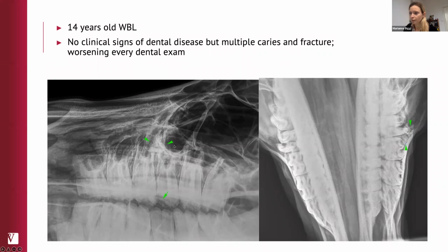So I'm quite happy that there is periapical remodeling associated with this tooth. There might be other fractures on other teeth, but I don't think we'll be confidently able to diagnose them based on these projections.